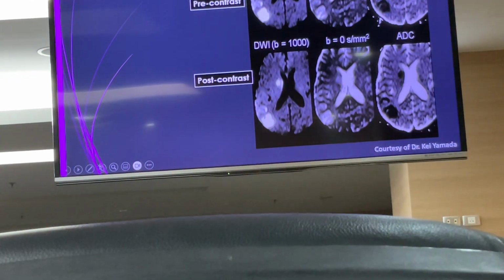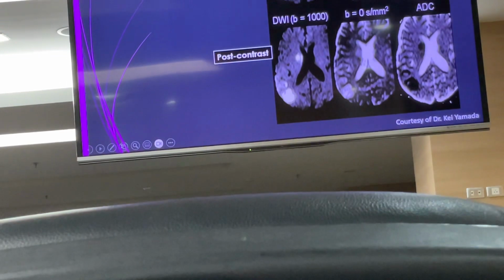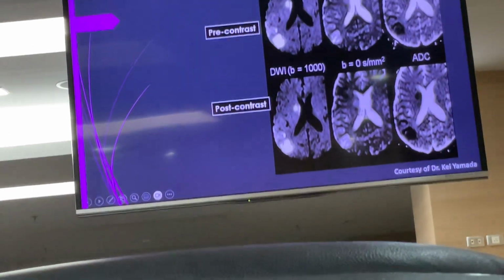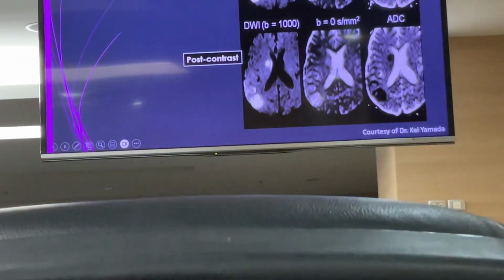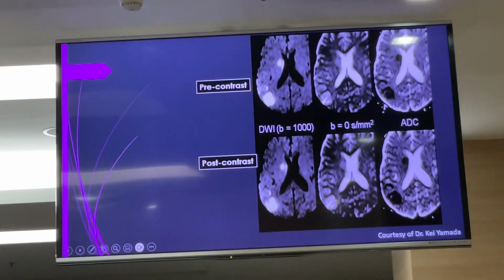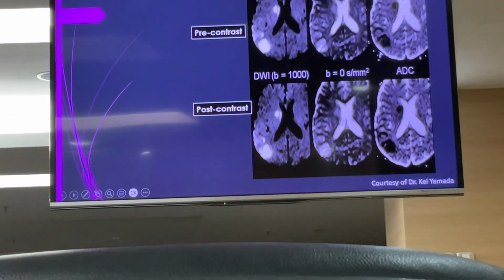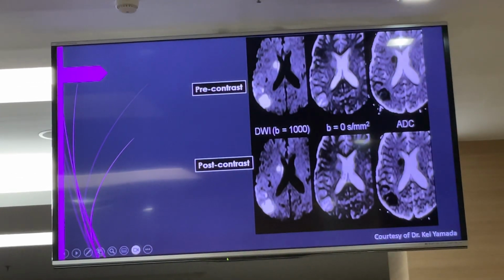And the question I often get from clinicians on site or from my residents is that the DWI was bad, and the patient was moving. I just check the contrast already, but the DWI image is bad, you cannot evaluate it. How do we do this with the DWI? I just tell them, you can scan it again. So the resident asked me, can you still evaluate the diffusion imaging after the contrast study? I just tell them that you can.